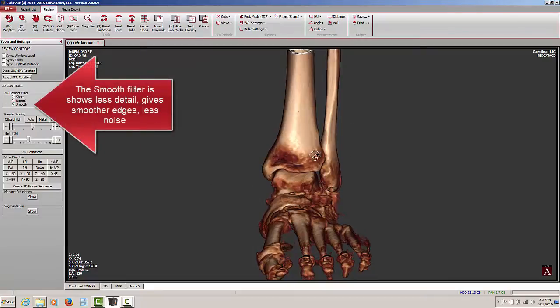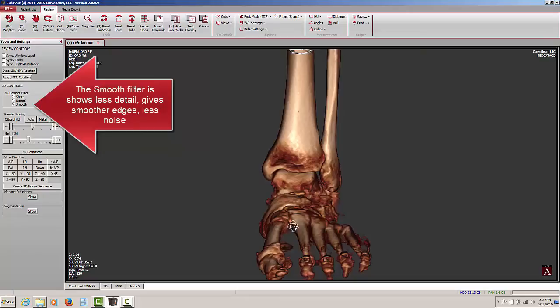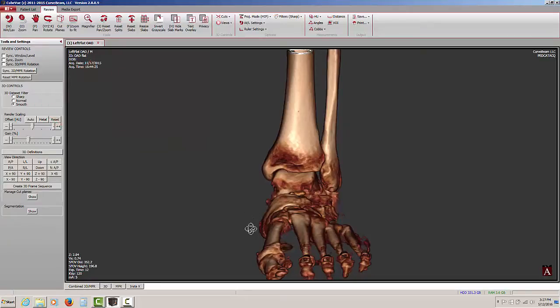Clicking on the smooth filter, we see it kind of smooths out any detail, but it also reduces noise in places like between the toes or if we had 2 feet, between the 2 feet.